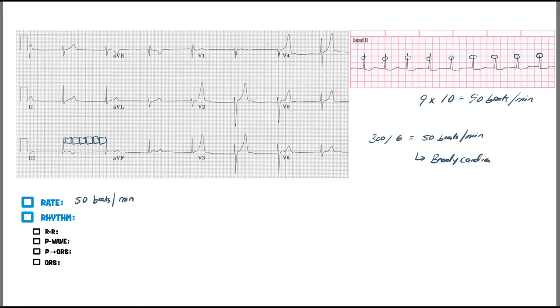We don't have enough of a rhythm strip, so it's a little bit difficult to determine, but looking at it, it does appear to be regular. If we had a rhythm strip in lead two or three it would definitely help us get more QRS complexes. We're going to go ahead and say that it is regular, though it's hard to be certain.